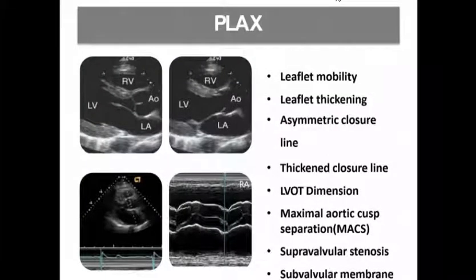This is the parasternal long axis view, where your axis should be such that the aorta and LV are in the horizontal plane. That is correct. If you do not get it right, you miss the dimensions and wrongly calculate the annulus size and the sinotubular junction. That is very important for the surgeon to decide what size of valve is needed to implant.